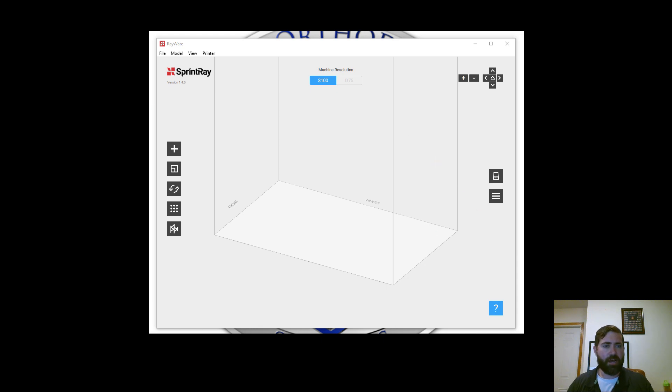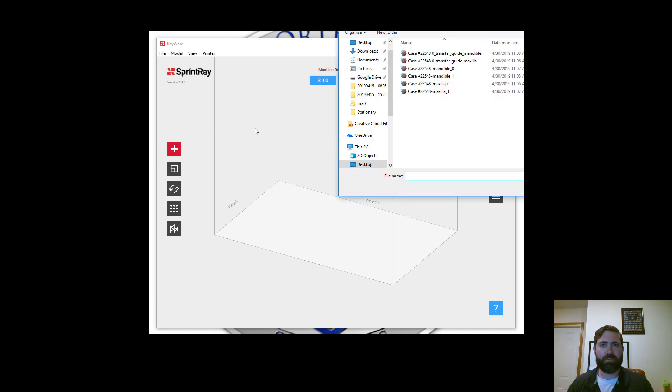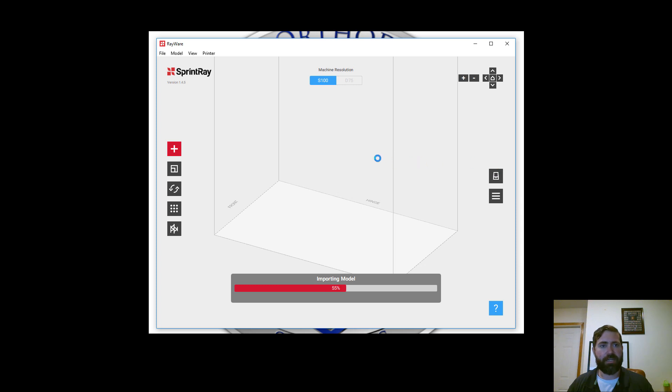Hello, this is Matt Standridge again. I am going to be doing a video now showing the printing process of the indirect bonding trays. In my last video, we had designed indirect bonding trays, and here I'm going to be using the Moonray S printer.